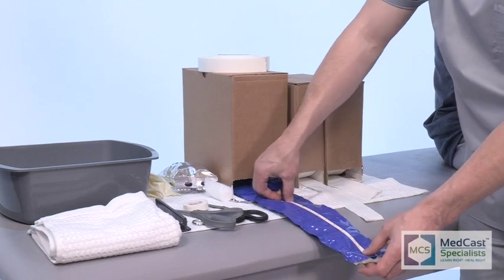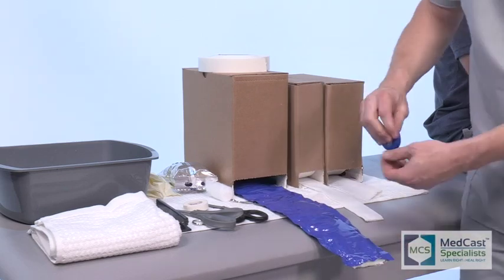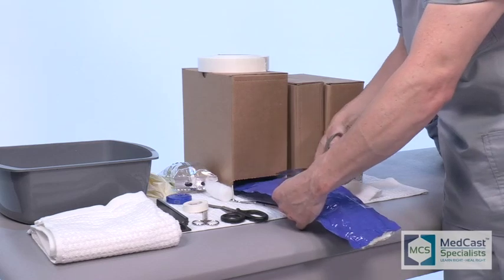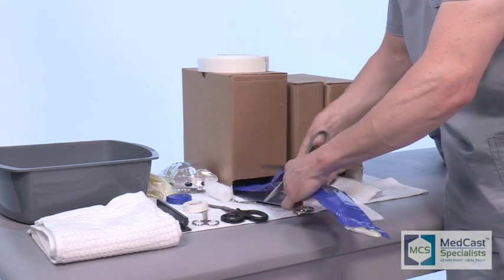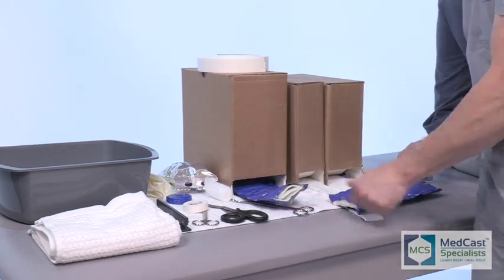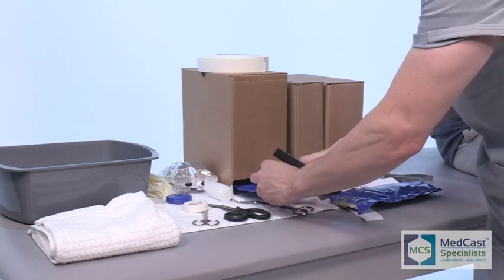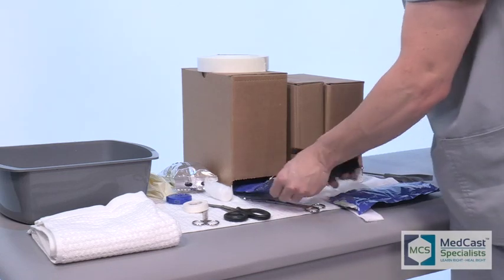It's important to remember how long the patient is going to have this cast on. If you're transitioning them from a splint into an ulnar gutter cast, it's important to put a little bit of buffer between the fourth and fifth digit before you put on your cast padding. This helps keep it from macerating between the fingers and makes it a little more comfortable for them.